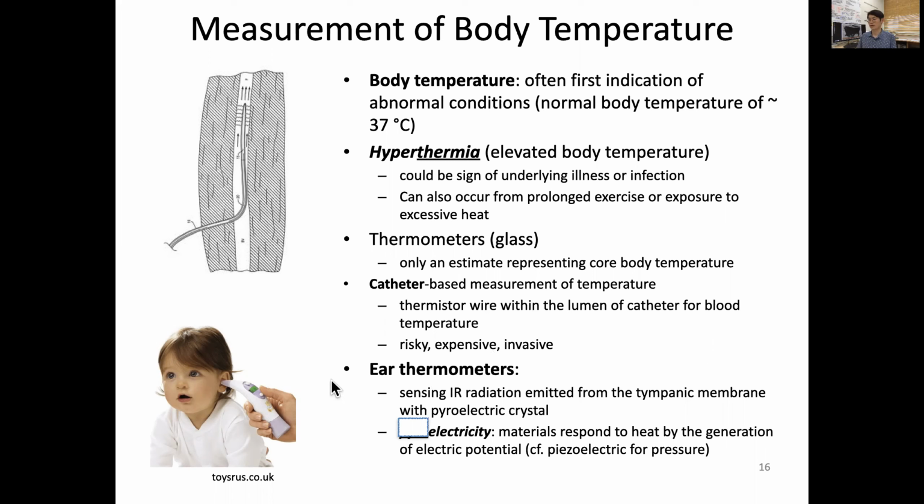An ear thermometer senses infrared light radiation emitted from our tympanic membrane with a pyroelectric crystal. What does pyroelectric mean? Pyro means thermal, so the material responds to heat by generating electric potential. It's like piezoelectric, where piezo means pressure-induced electricity. Pyroelectricity is thermal-induced electricity.